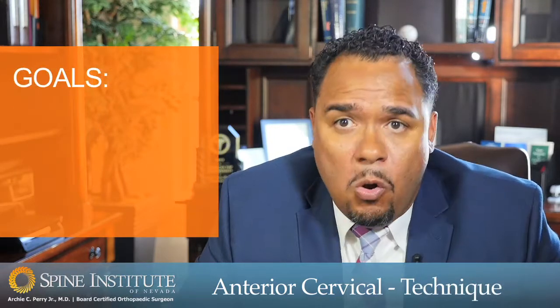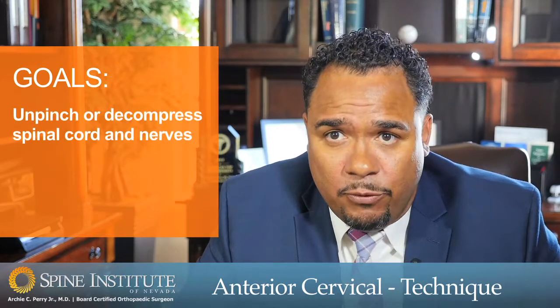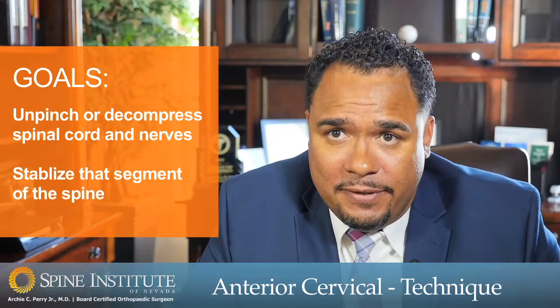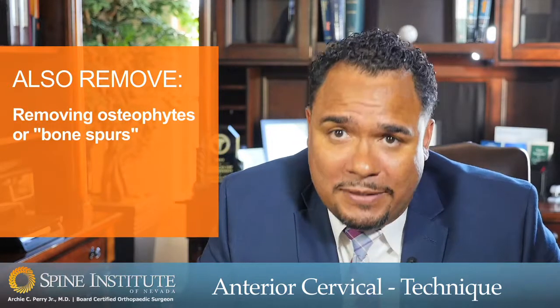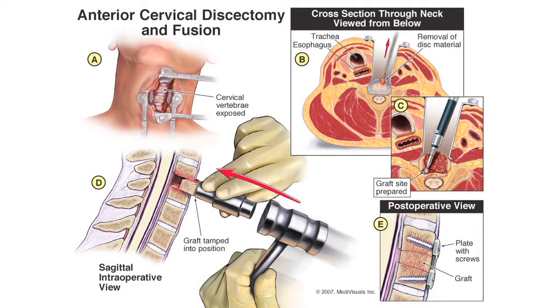The surgical goal is twofold. One is to unpinch or decompress the spinal cord and nerves. The second goal is to stabilize that segment of the spine. We do that by removing the disc in its entirety, and by directly removing that disc material we can decompress the spinal cord and nerves. Oftentimes there are also bony projections called osteophytes — most people refer to these as bone spurs — that also require careful removal from the surface of the spinal cord and nerves.